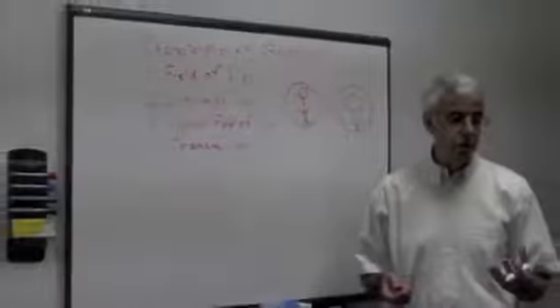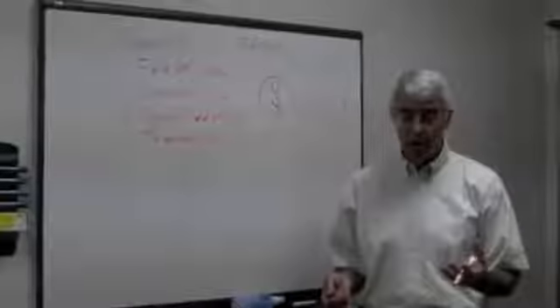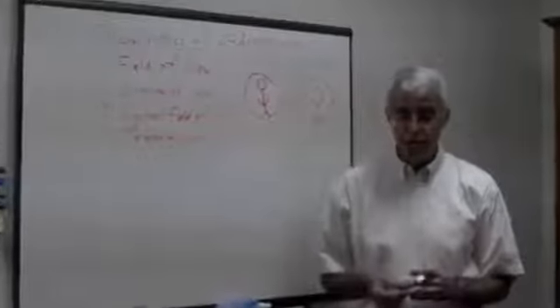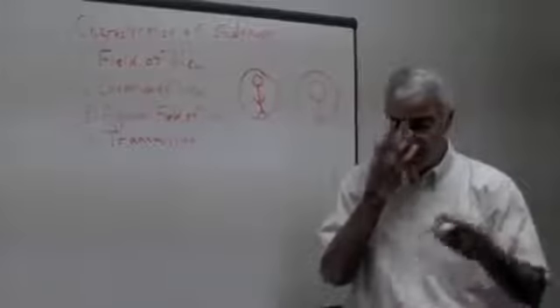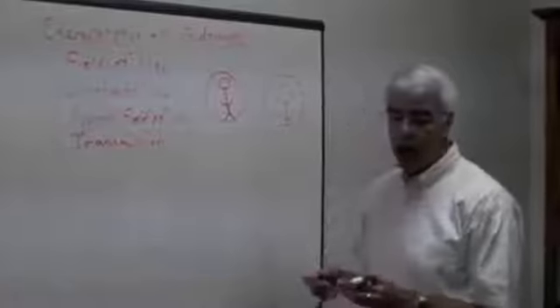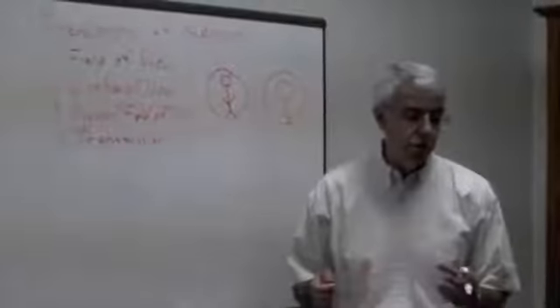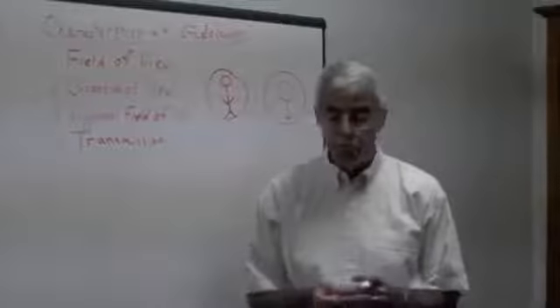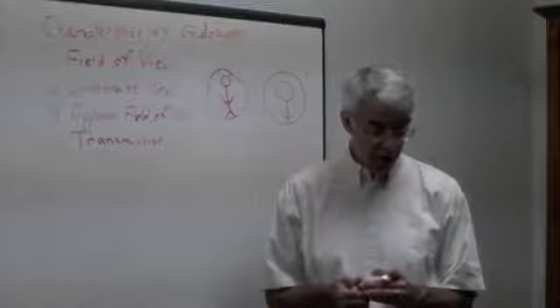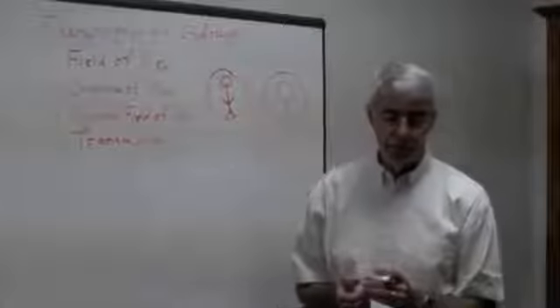The higher the transmission, the brighter the image, the less gain that's required from the camera, and so the less noise that will be produced by the camera if it's in an auto gain situation. So we care about the transmission of the endoscope, and it's just like what you would think it is. It's the amount of light that's able to go through the lens system.